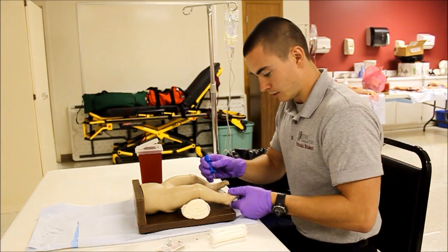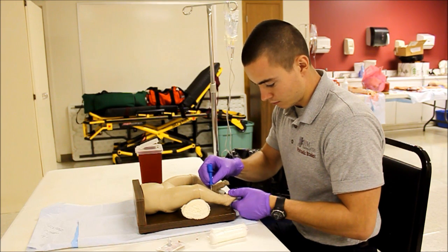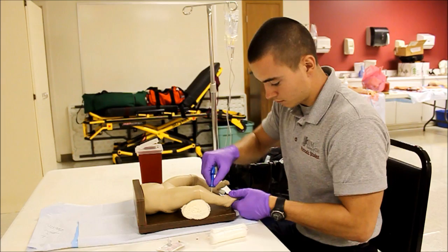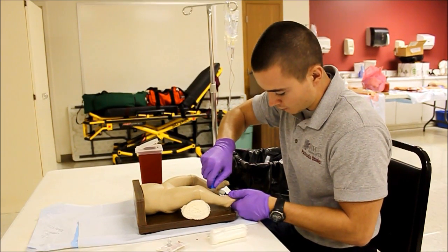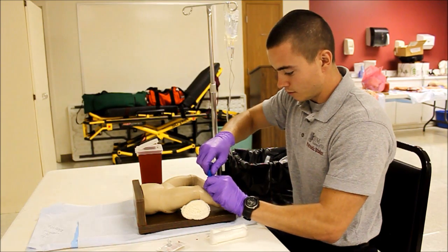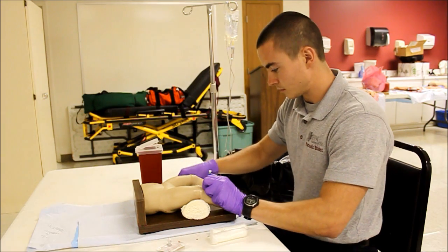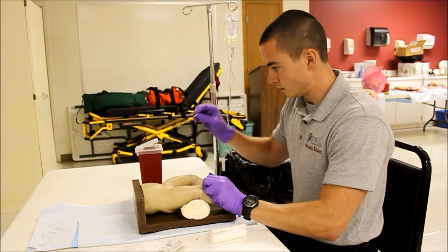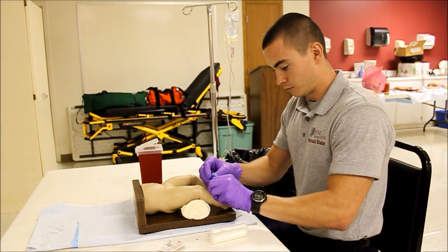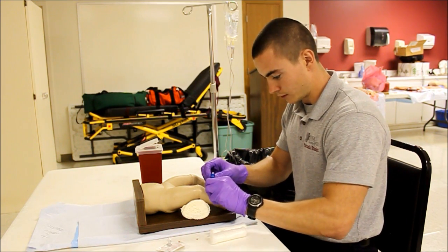I'm going to go ahead and stabilize the patient's leg. I'm going to insert at a 90-degree angle, pushing downward and twisting. Once I feel the pop, I'm going to go ahead and stabilize my needle, then remove the stylet. I'm going to dispose of my sharp in the sharps container. I'm going to twist the needle so it's flush with the patient's skin.